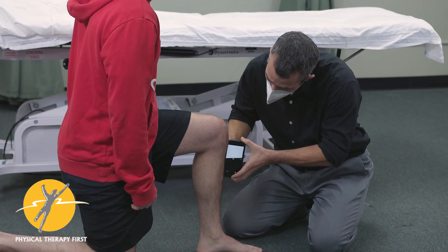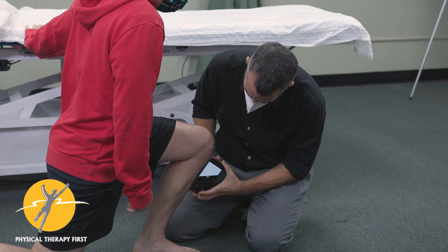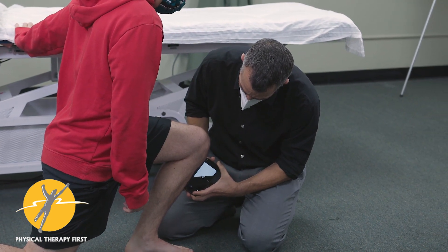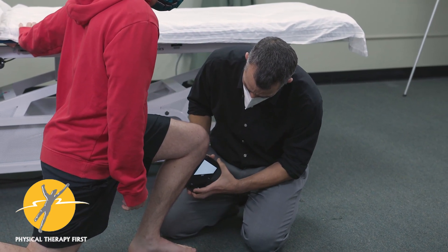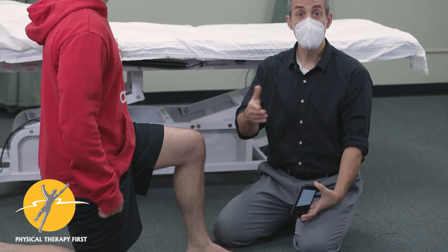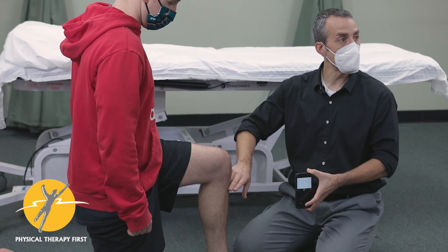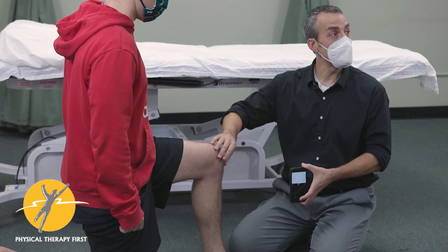Come back, zero it out, then lean forward on the other side. He's at 38 to 39 — equal on both sides. We just did manual therapy to both of those, but in the clinic this is a quick and easy way to measure dorsiflexion.